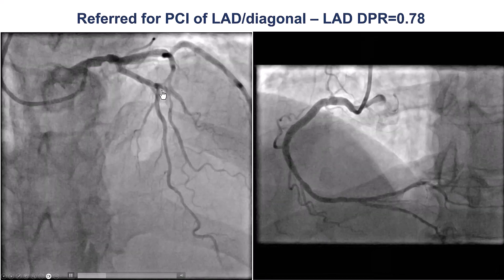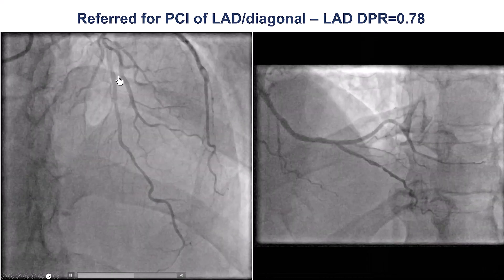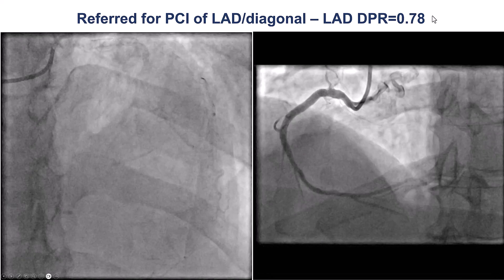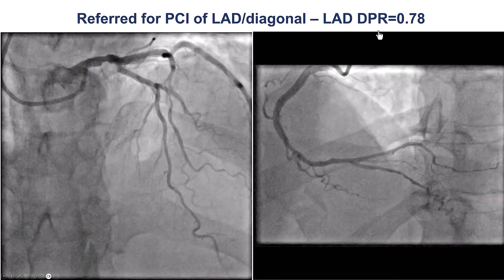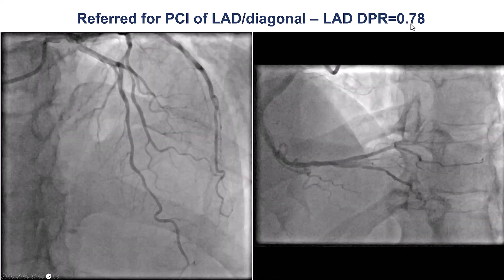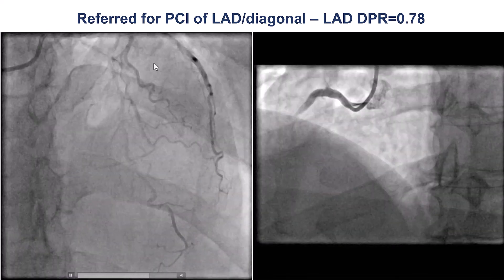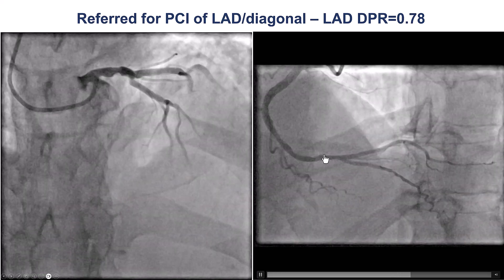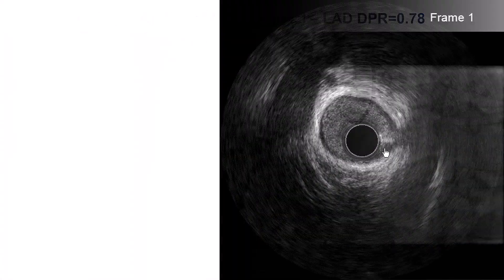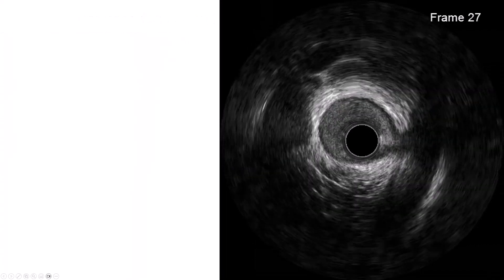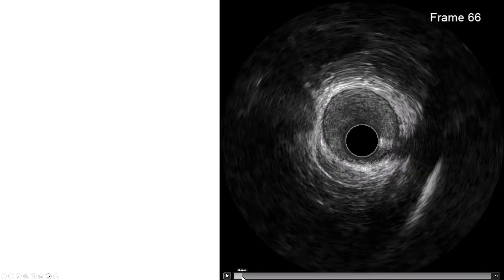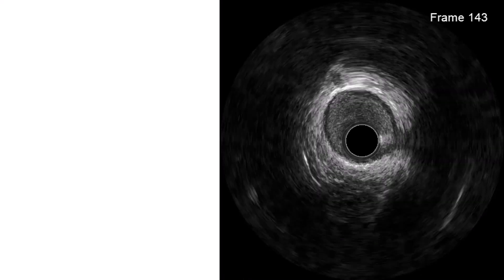In different views showing the diagonal lesion, the LAD doesn't seem too bad, but the DPR was 0.78, which is the equivalent of the IFR, and the step-up was right at the bifurcation. There was no significant disease in the right coronary artery. This is intravascular ultrasound, which is very important where there's some discrepancy between coronary angiography and physiology.